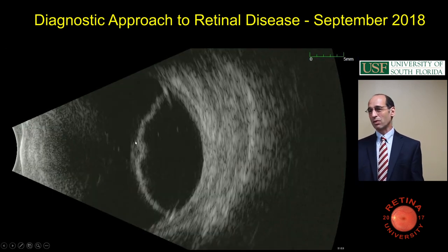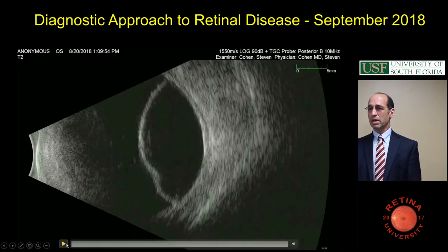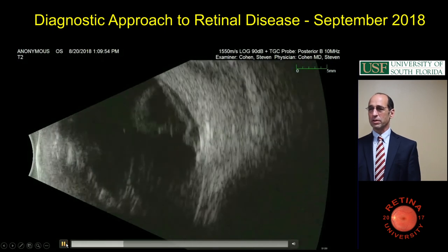I don't normally ultrasound detachments. I got it for teaching purposes. See how it goes all the way out? And it moves, but the other one moves too. When you do dynamic, the eye wiggles some.